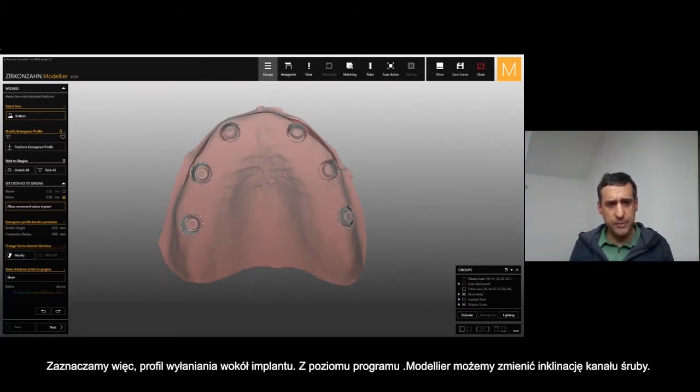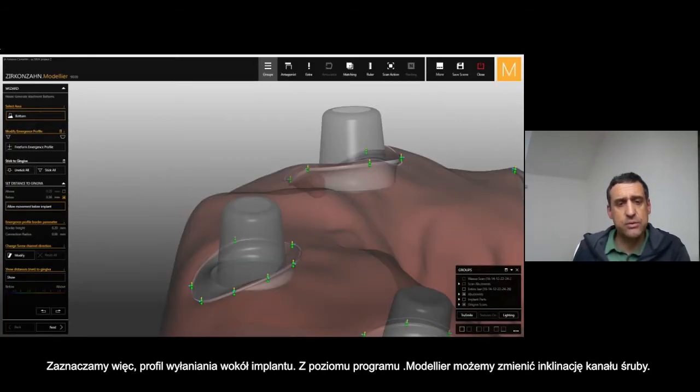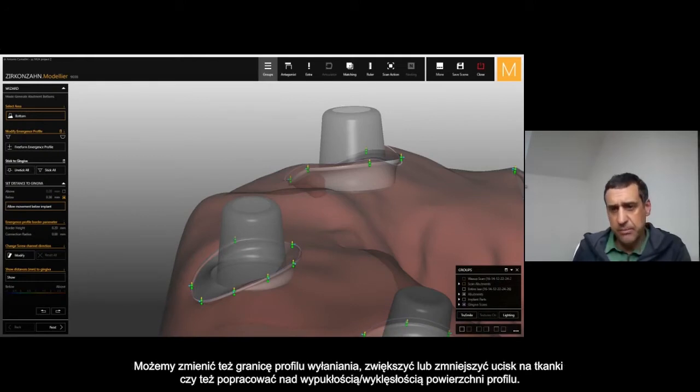I have the option to manage the area around the implants in different ways — it is not directly connected to the implant, but I have more options to manage this area around the implant. We can also change here from modify the inclination of the channel screw, and we can manage the border — more pressure into the gingiva, less pressure, concave or convex as you want.